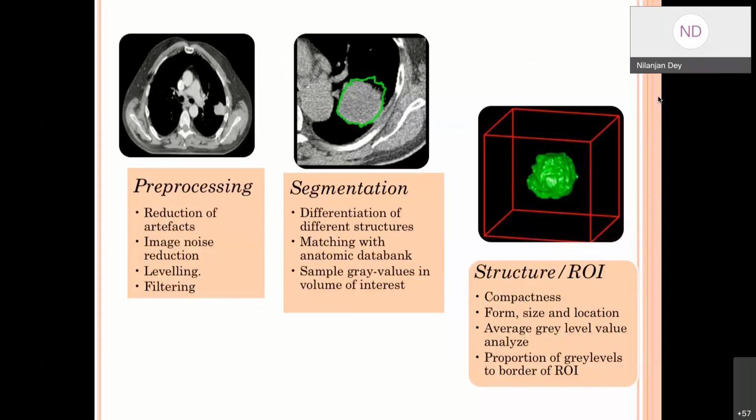But remember one thing, once you improve the quality of the image, it should not destroy the diagnostic value of that particular image. If the diagnostic measures of the image somehow get lost, that means you are losing information. See, once you are doing pre-processing, you are actually going far away from the actual image. So there is a high chance that you are losing the diagnostic measures. So you have to always try to retain those diagnostic measures. In that way, we can only pre-process.